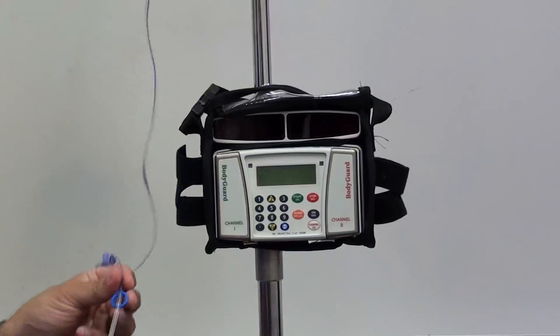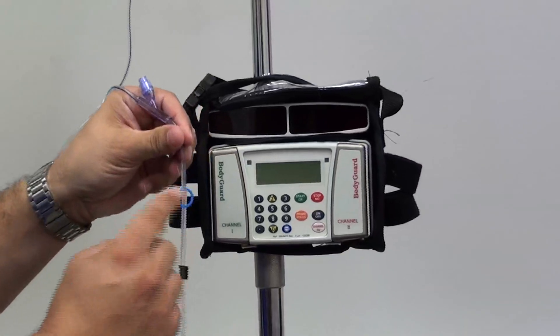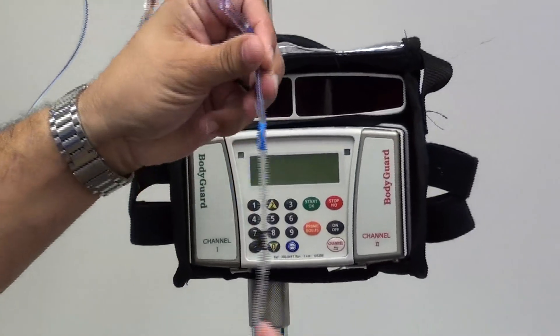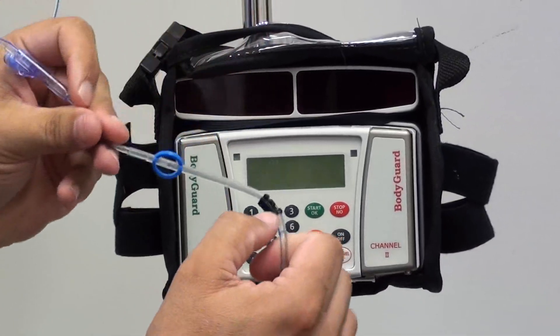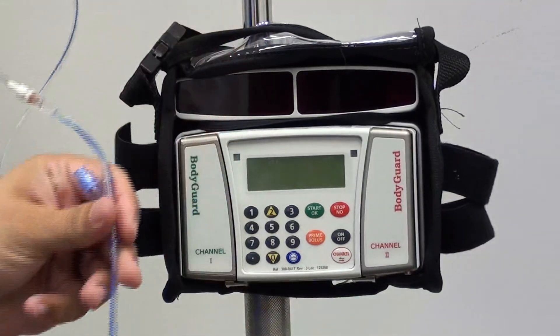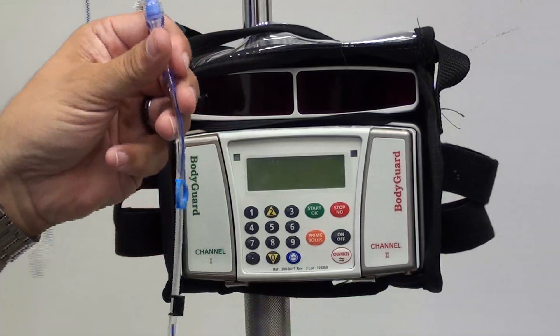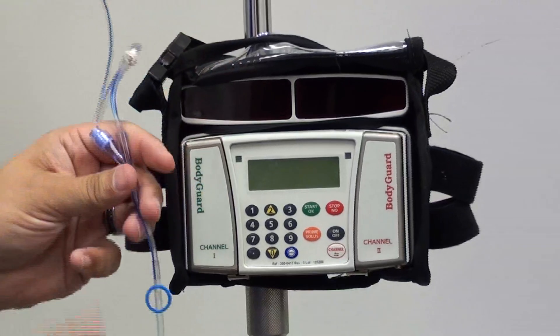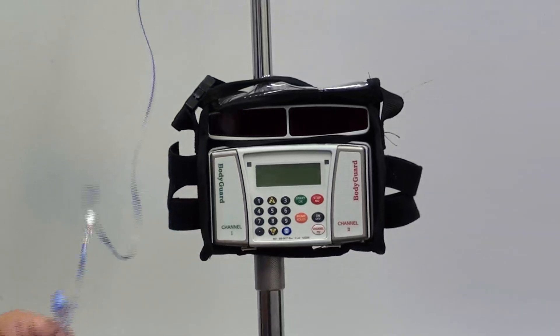First we're going to look at the tubing. You'll see that the tubing has a blue ring as well as a black key that looks like a jigsaw puzzle, which will be placed into the side of the pump. The pump also has a free-flow preventer built into it, so the medication cannot be administered to the patient faster than you want it to.